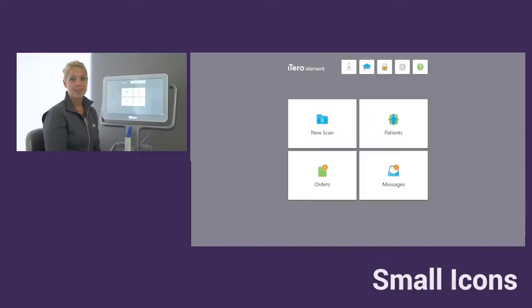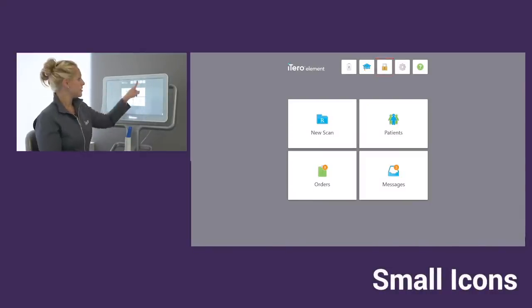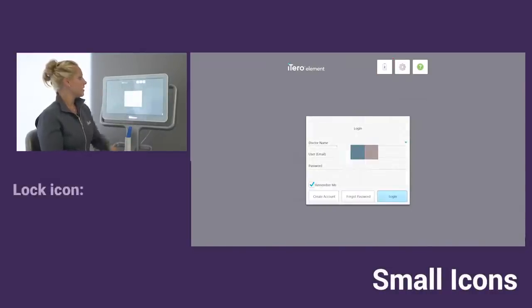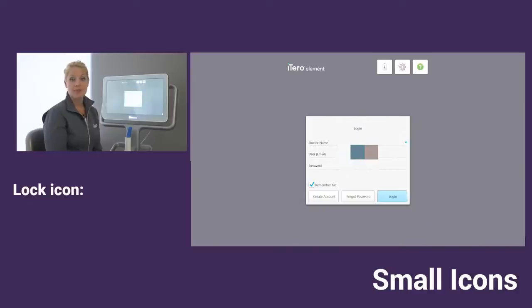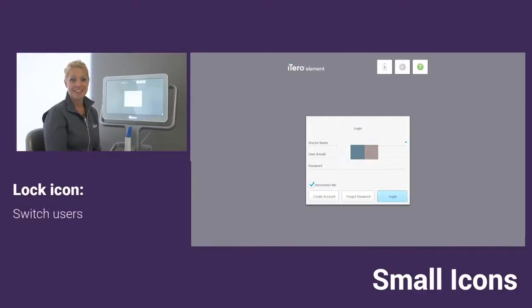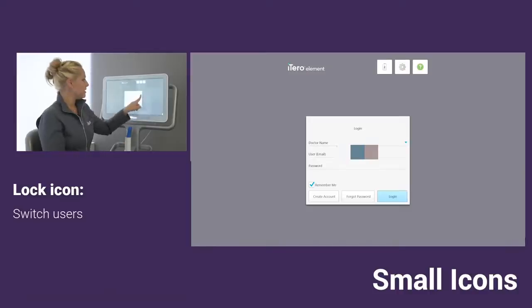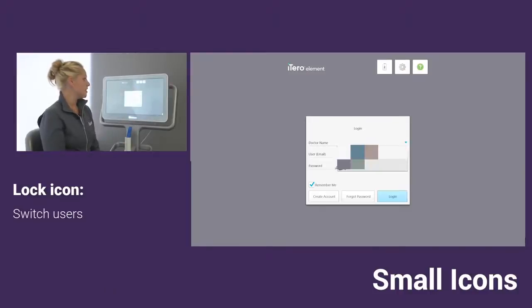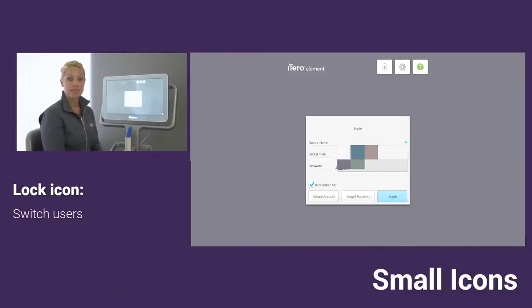Next, we're going to talk about the lock icon. When I tap on lock, this allows me to do three things. First, it lets me switch the user that I'm going to be scanning under. I can tap on the blue drop down arrow and you'll see that I have the option of selecting the doctor.